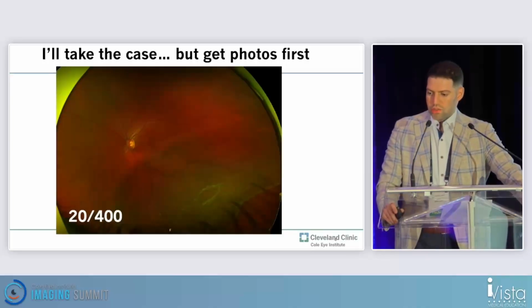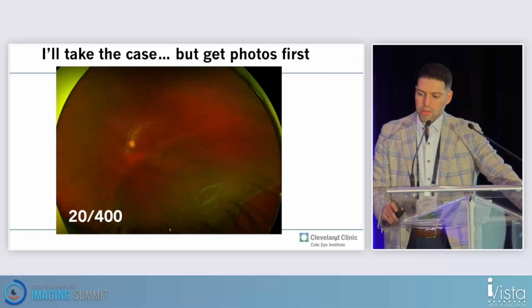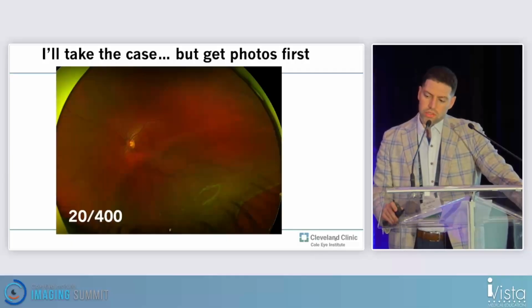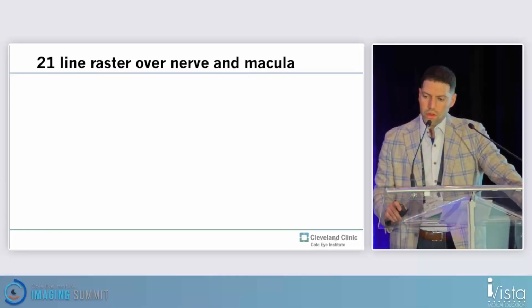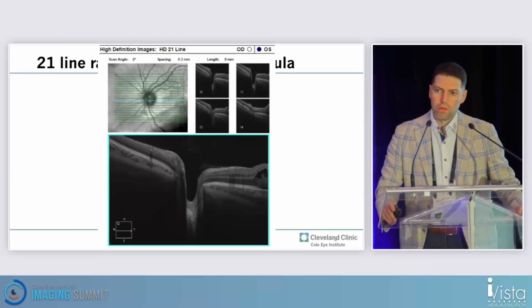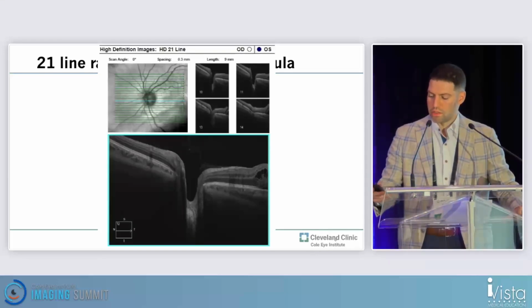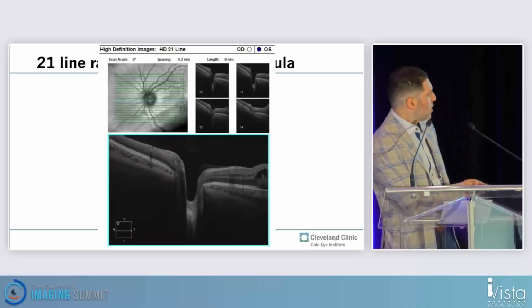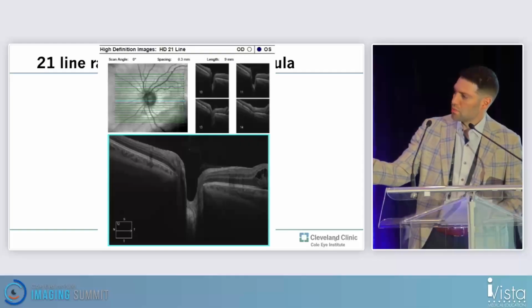Here's the patient. You see a macula involving, fovea potentially sparing retinal detachment. We see some potentially early PVR infratemporally, and there's either a retinal dialysis or a large giant retinal tear. You'd have to depress to see what's going on there. But more importantly, I have an OCT, and it's looking at not just the macula, but also over the nerve, and we can see that the hyaloid is very much attached. Here we can see that the posterior vitreous is definitely attached on this picture.